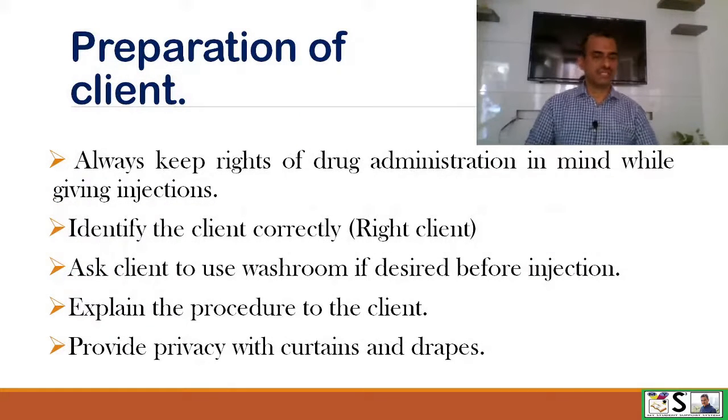Now preparation of client. Always keep rights of drug administration in mind while giving the injection. For rights of drug administration, you can watch the previous lecture on oral medication. Identify the client correctly. Ask the client to use the washroom if desired before injection. Explain the procedure to the client. Provide privacy with curtains or drapes.